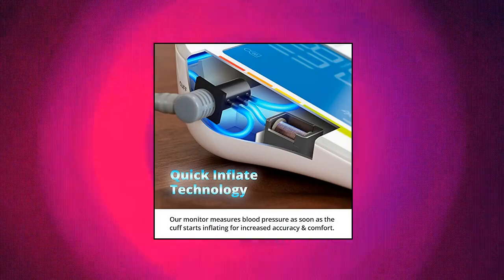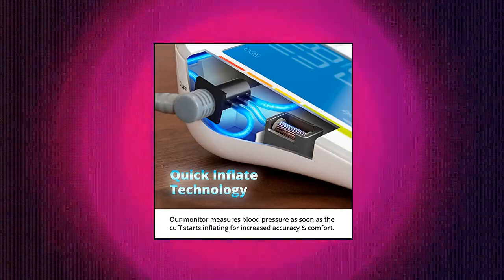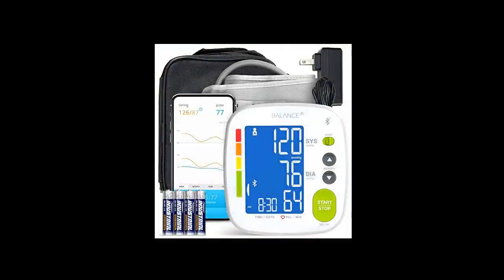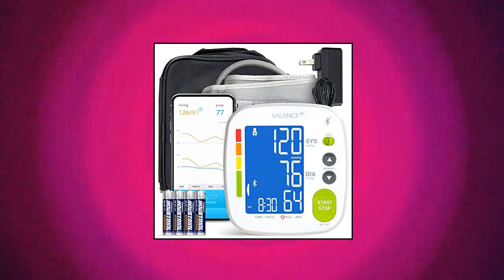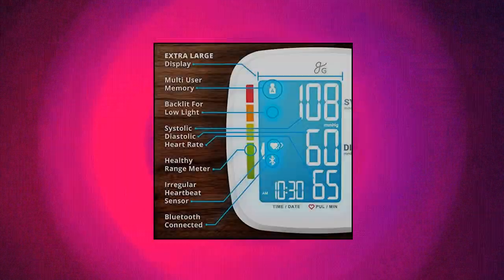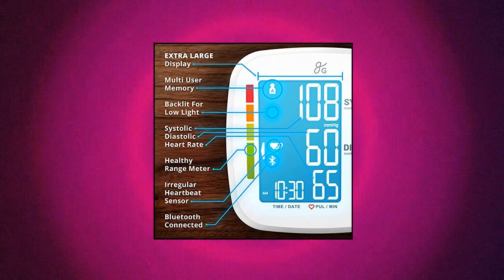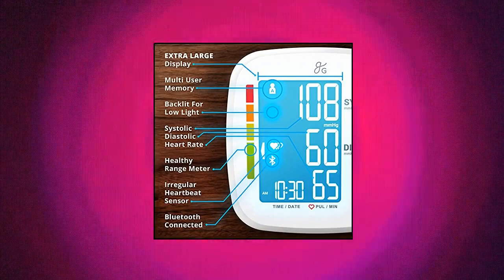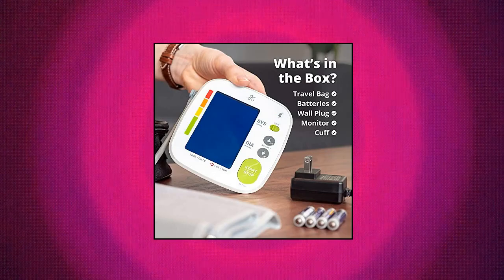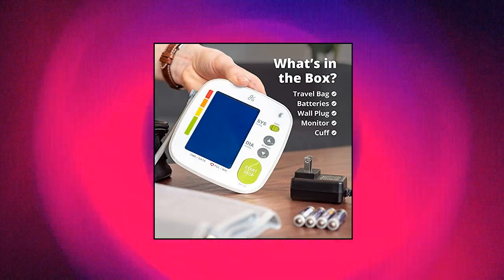Bluetooth Blood Pressure Monitor Cuff by Balance with upper arm cuff. This monitor kit comes with everything you need to make tracking heart health over time as simple as possible. Keep up with your systolic and diastolic blood pressure as well as your pulse. Compatible with two users, storing up to 60 measurements for each. Features a bright backlit display, large stop/start button, and an irregular heart rate detector.